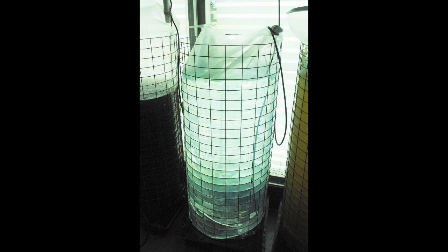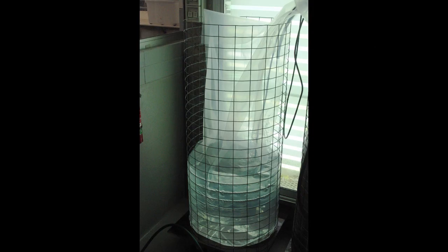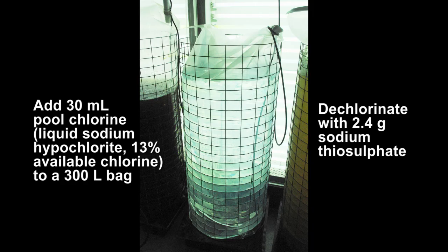300-litre bags cannot be autoclaved. They should be filled with 1 micron filtered seawater. Next, they need to be chlorinated, left to stand overnight, then dechlorinated. Next, add 11 grams of the soluble fertilizer, Aquasol.